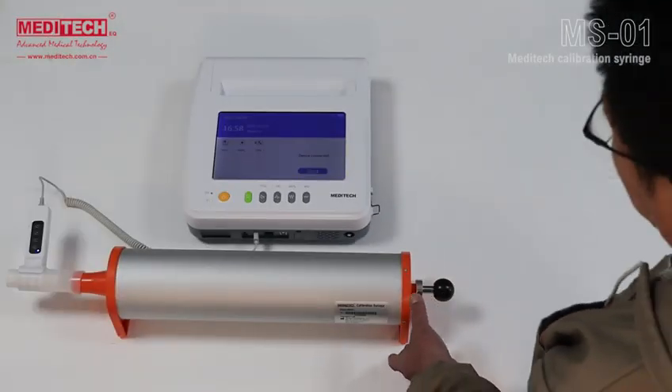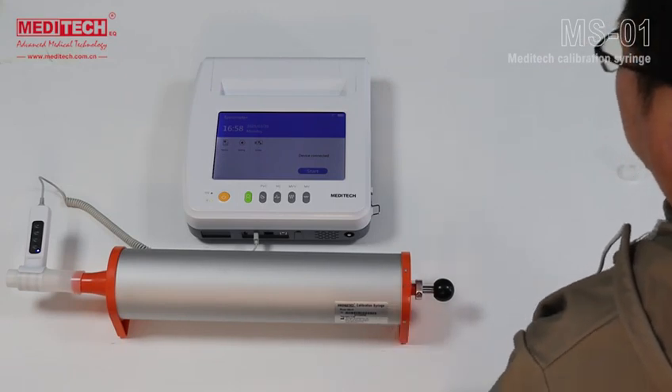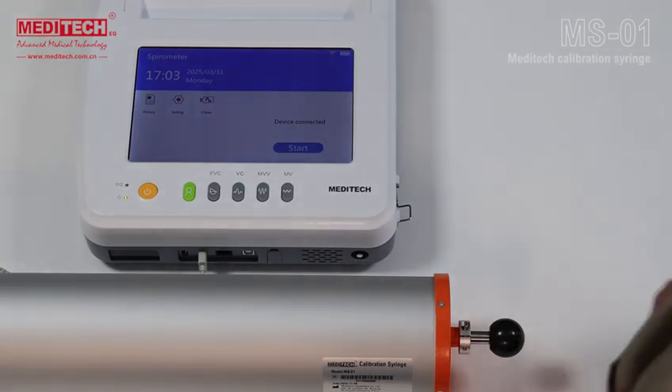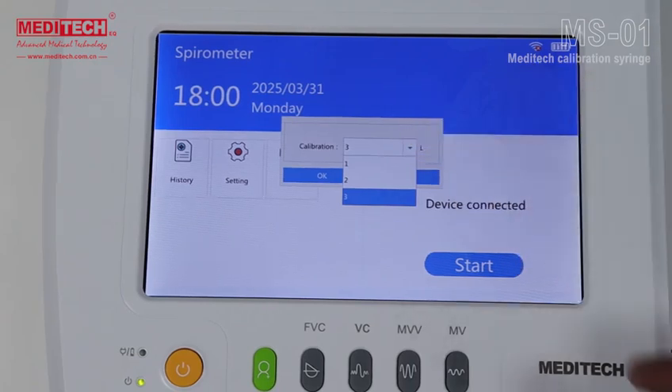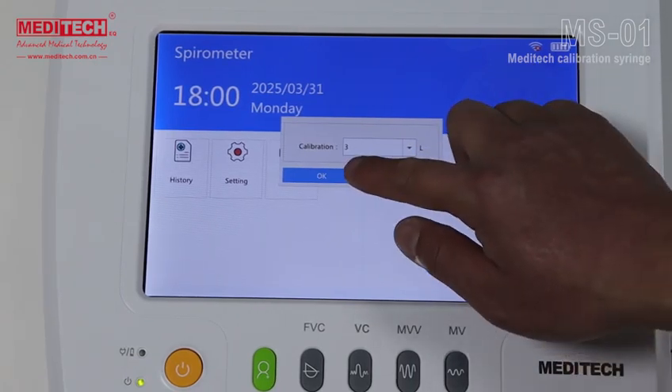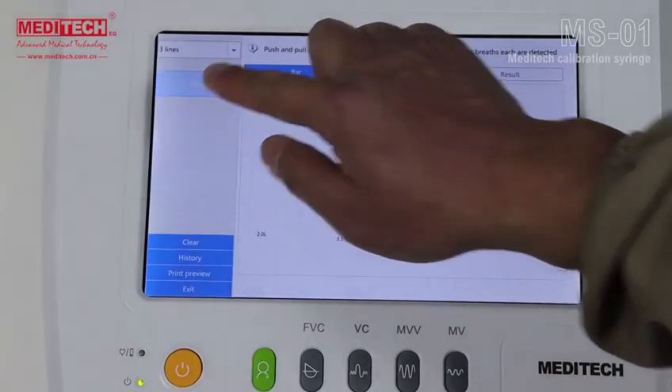The next step is to carry out the actual calibration test. First click on the three-lines symbol and select the calibration parameters. For the iBreathe spirometer, the 3-liter calibration is selected. Select 3L and click OK to enter the next interface, then click the Start button.